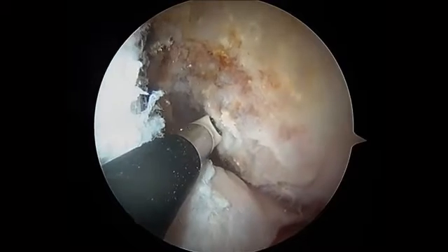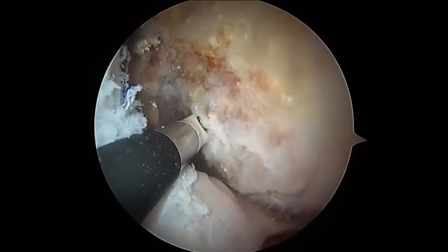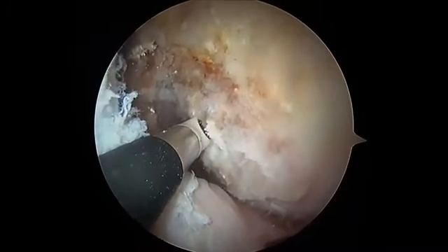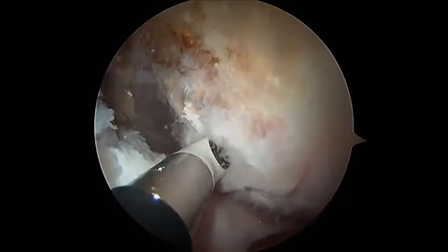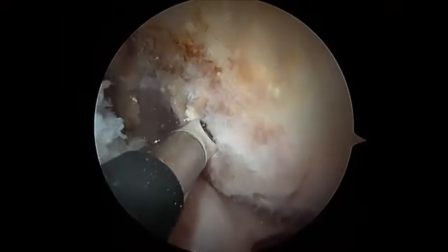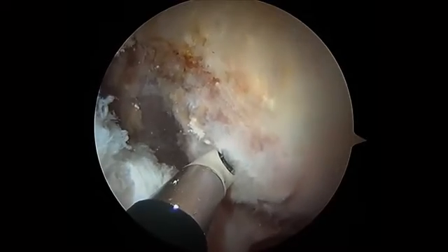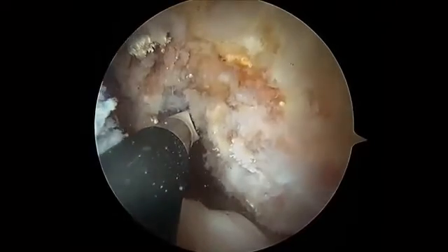And the L is low tension. We feel from David McAllister's work that this is a low tension region of the footprint if you put your graft in this region, as opposed to putting your graft centrally or even lower. You see high tension on the graft just through a range of motion. So I'm going to look back here.